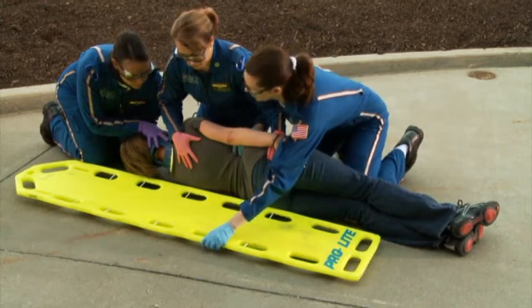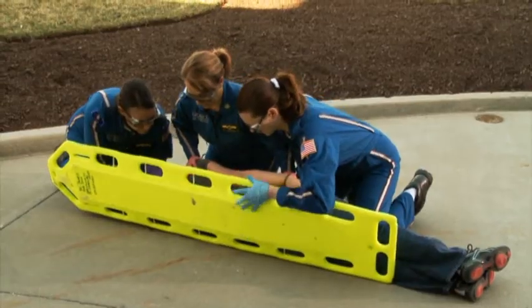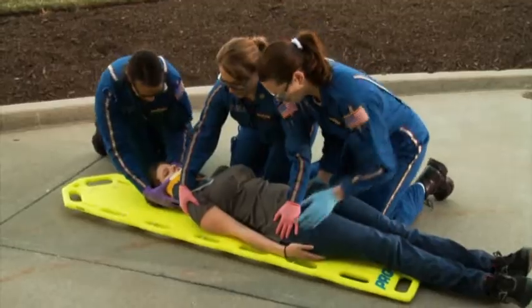The longboard is held against the patient's back by the second and third providers. On command from the first provider, the patient and the board are rotated to the ground.